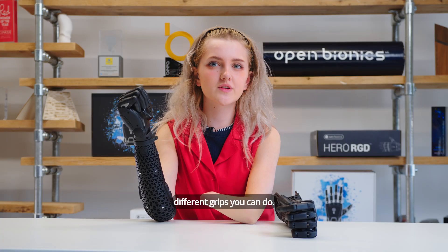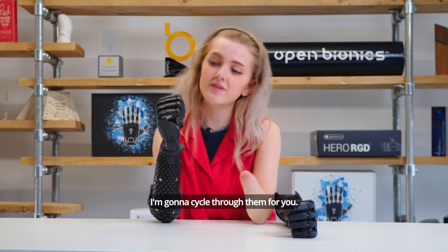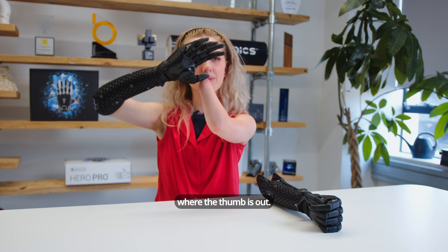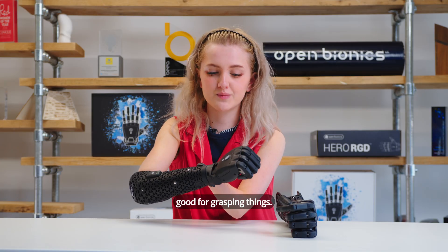With your bionic hand on, there are all sorts of different grips you can do, so just to demonstrate I'm going to cycle through them here. First of all you've got a grasp like this where the thumb is out. I squeeze my muscles and that can come down — really good for grasping things.